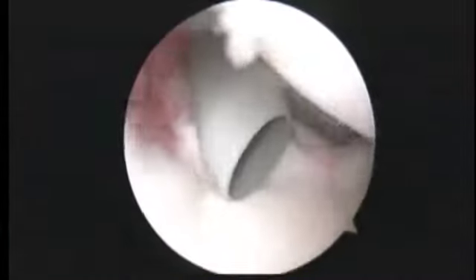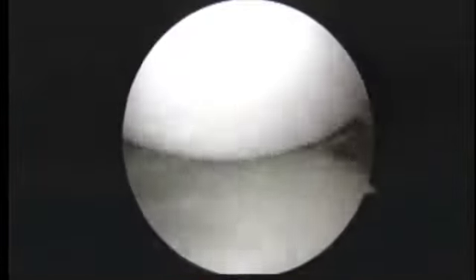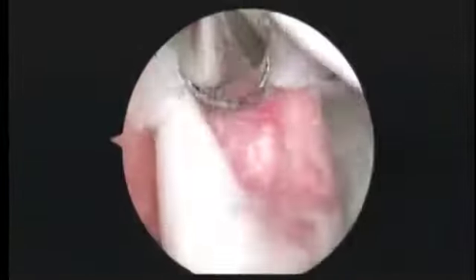So the next step is for us to put the camera in the front and have a look from the front to the back. But we are getting a pretty good idea of this kind of multi-directional instability picture, which is what we expected. Pause, please.